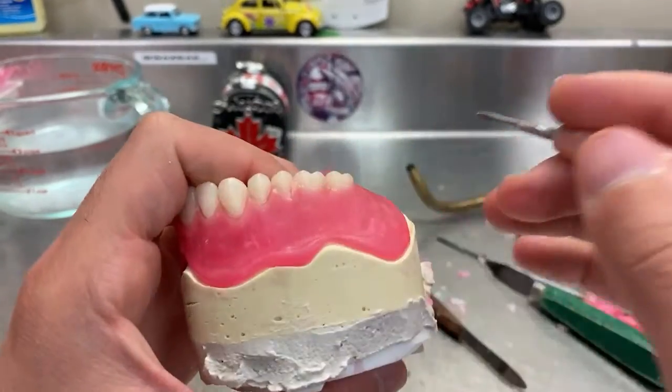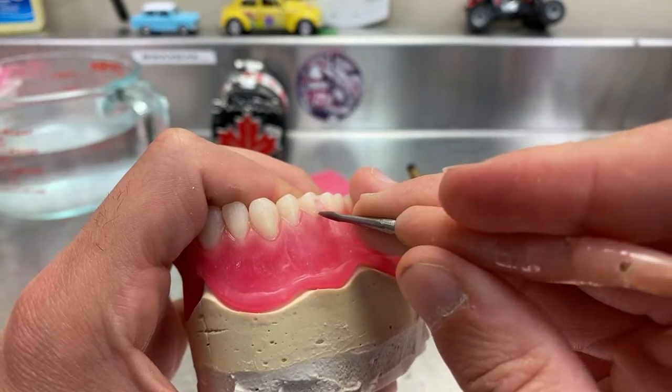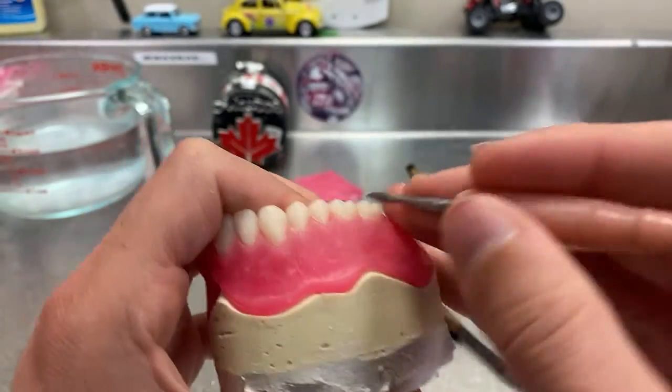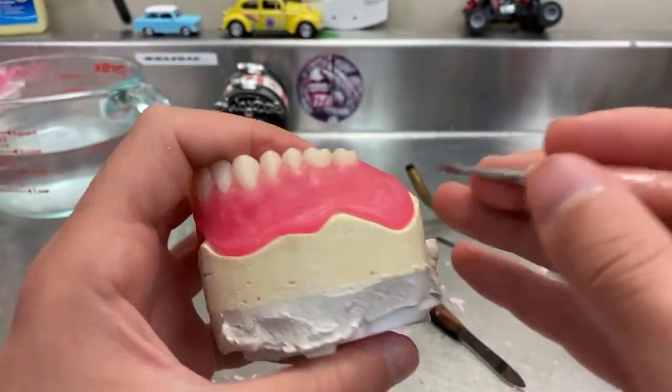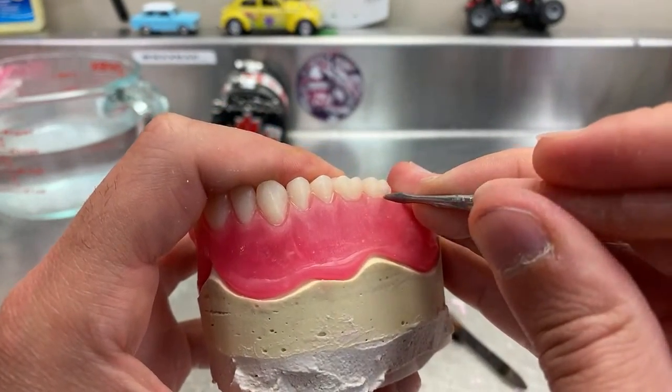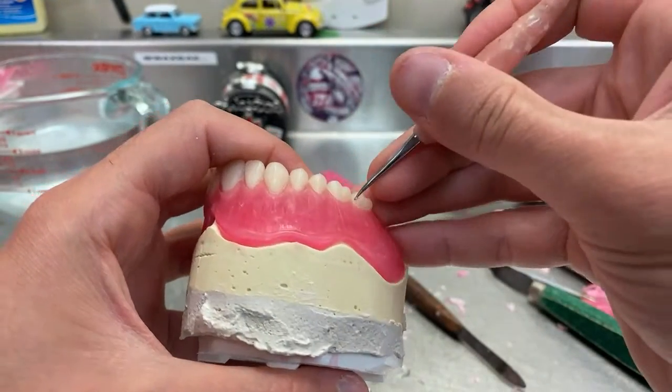So you have to find that middle ground between universal, aesthetics, and natural. Once you achieve all these three in one place, or find a balance between the three of them, you'll be able to make nice dentures aesthetically.